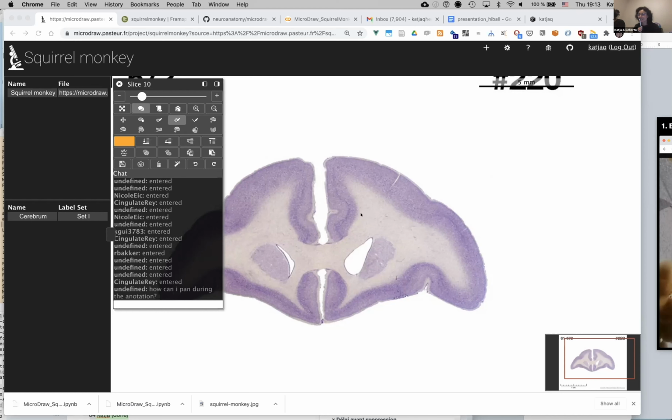Also, when you have done one slice, you can put "done" in parentheses behind your name, and you go for a next one.